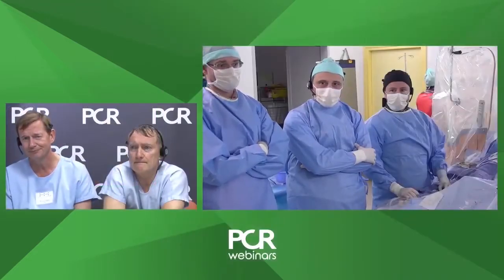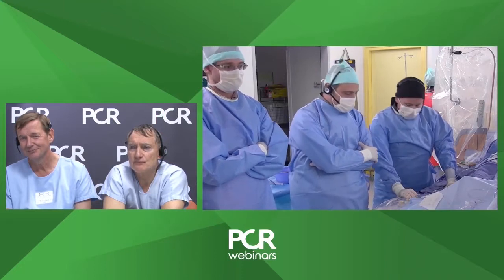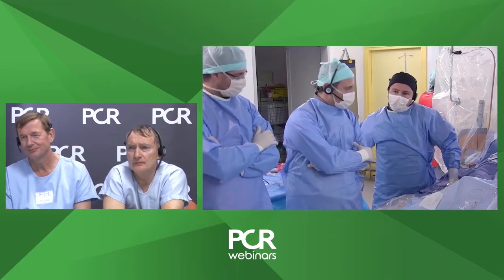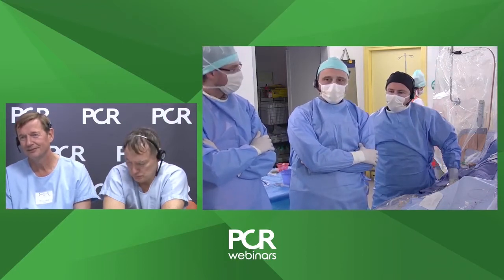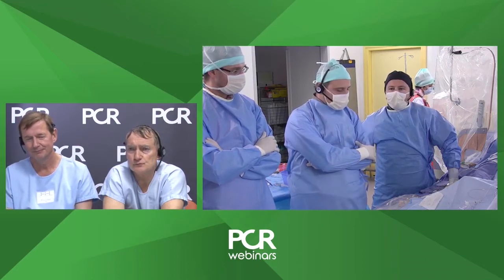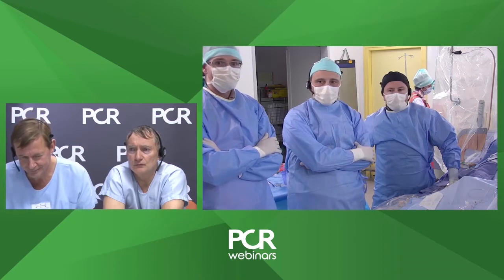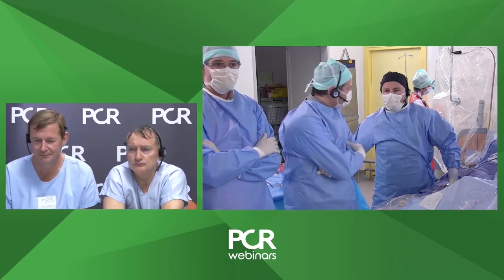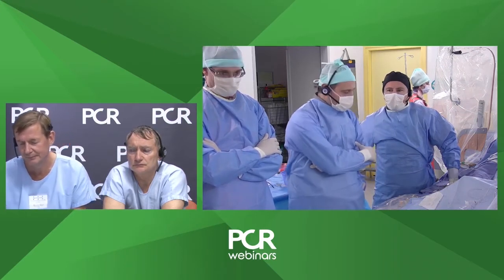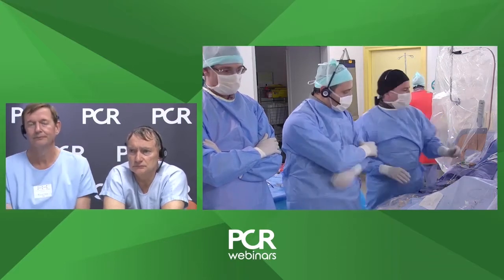Nicolas, I'm very happy to welcome you in our institution, in our cath lab, and I'm very pleased to work with Emmanuel Barbato. I also have to present all the team, Lionel, Jeremy, and Patricia, who will help us perform this case. I hope we will be able to give you a lot of explanation, especially educative explanation. Maybe we can start with the angio. Emmanuel will present the angio.